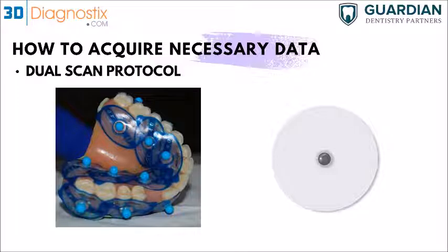And even if the patient has the denture already existing, you need to make sure that the denture is seated well and adapted well to the soft tissue, and there are no gaps between the intaglio of that denture and the soft tissue. So once you've made sure, you're going to get those radiopaque markers, which we can also provide you with, and they're basically stuck on the denture. You can see this image on the left side. You use these markers to stick them on the lingual side, and we recommend 4 to 6 markers on the lingual side and 4 to 6 on the buccal side as well. And then once you've set all these markers in position, you place the appliance back in the patient's mouth. You have the patient bite down on cotton rolls, and you scan the patient with that appliance.